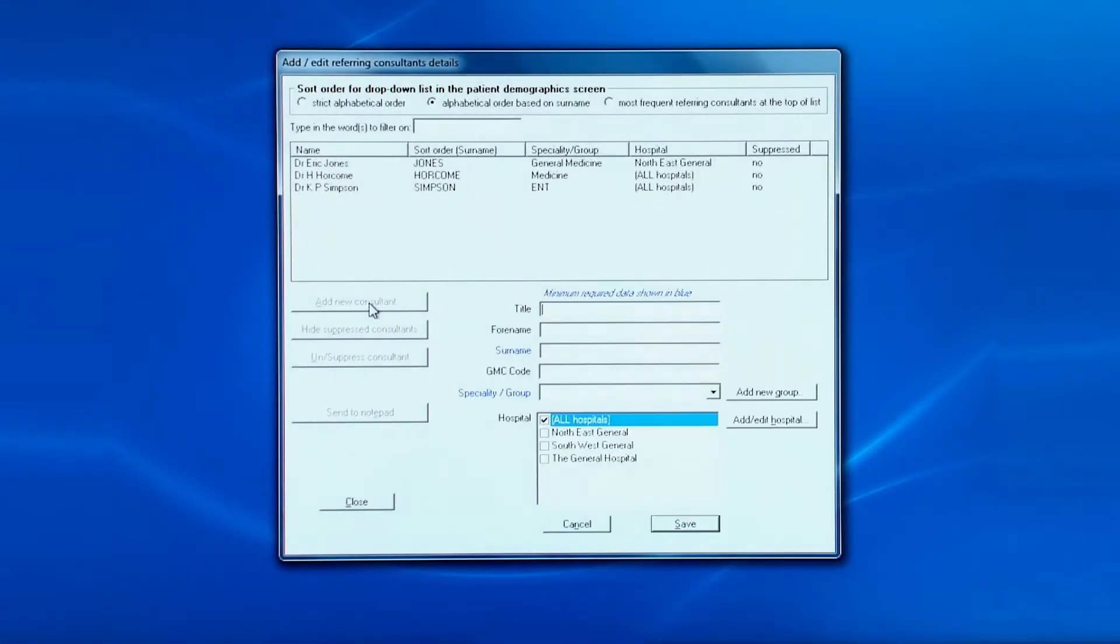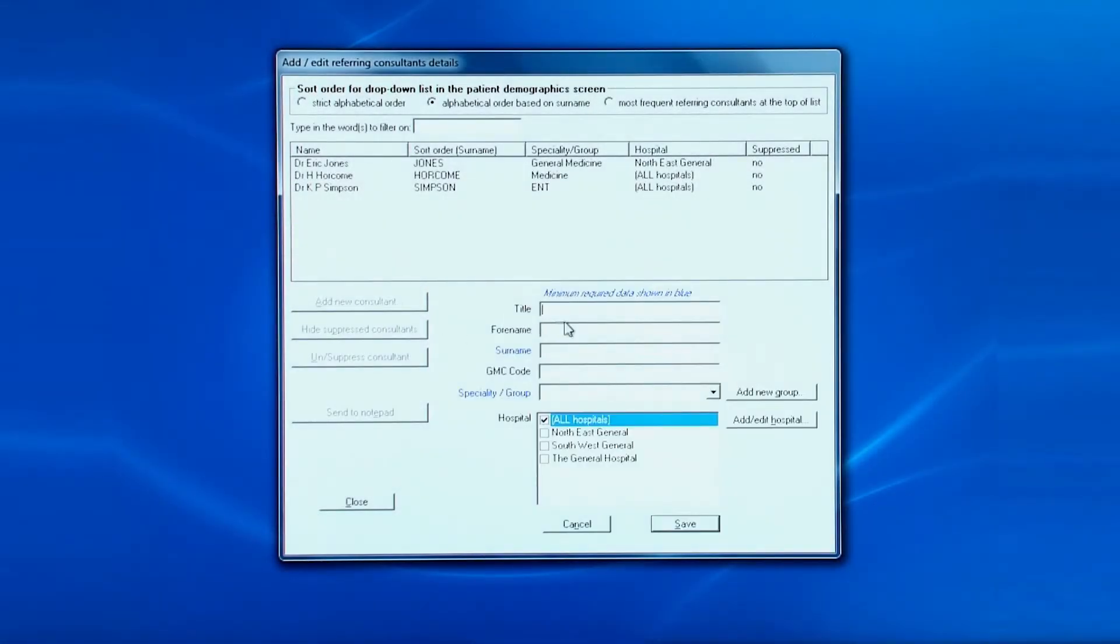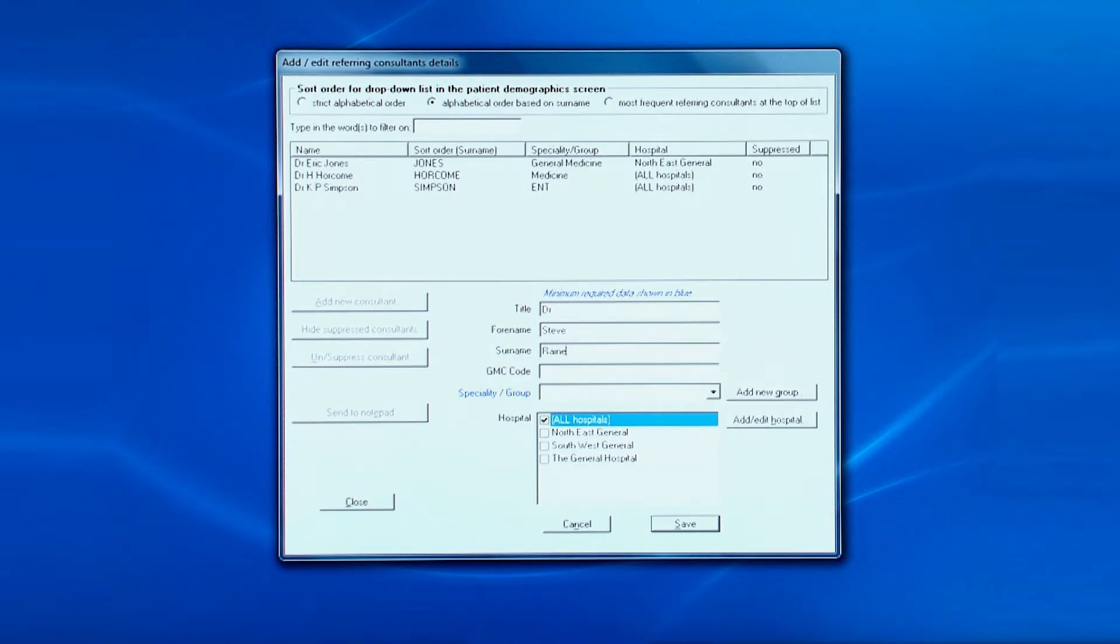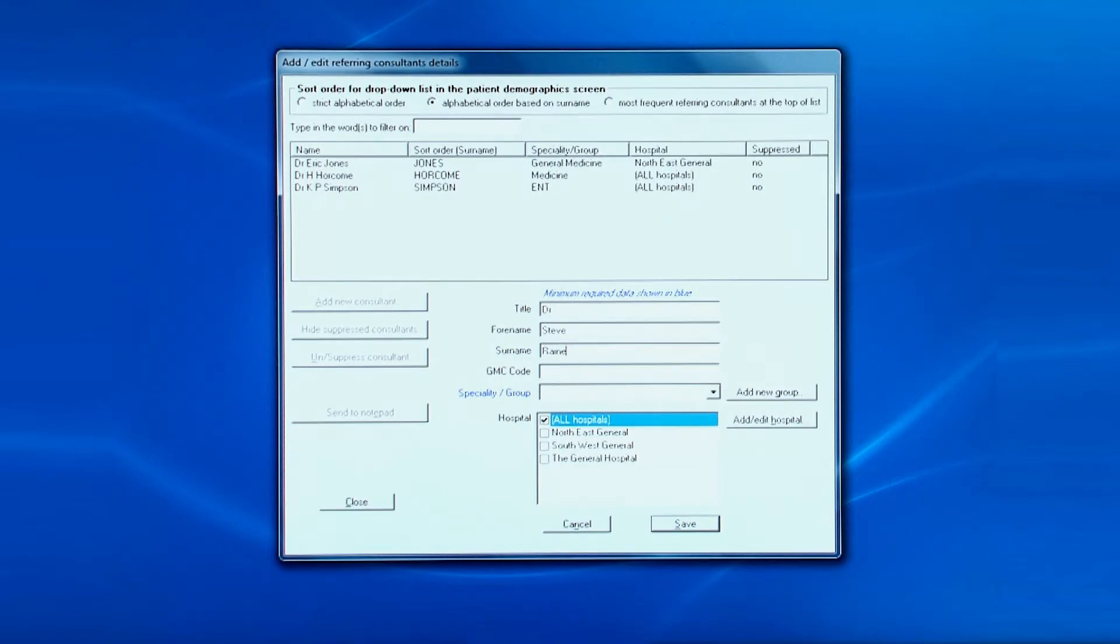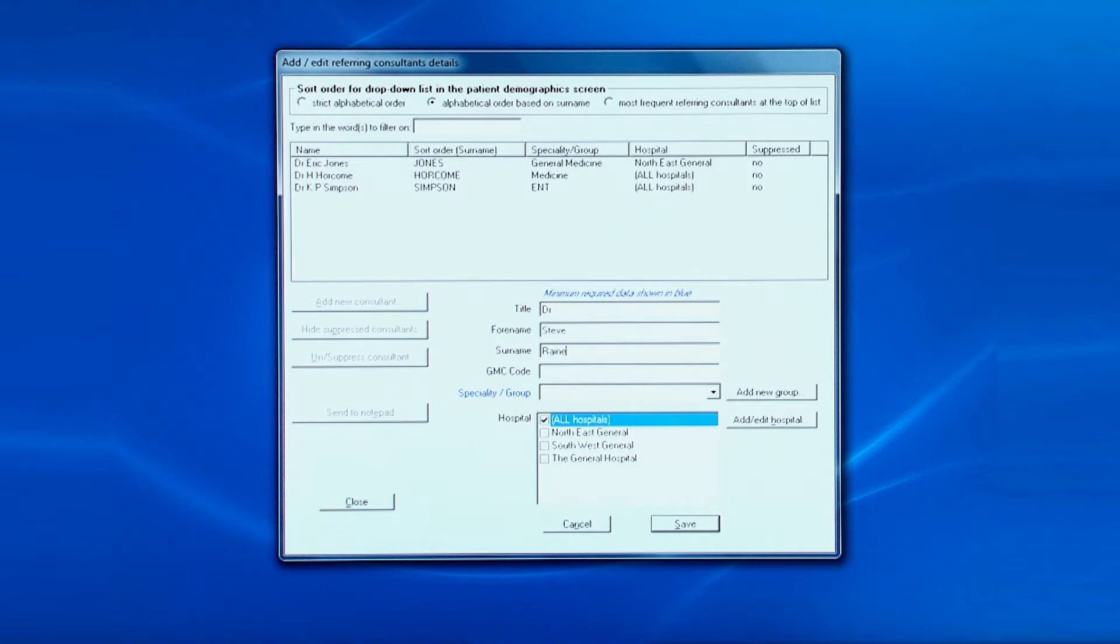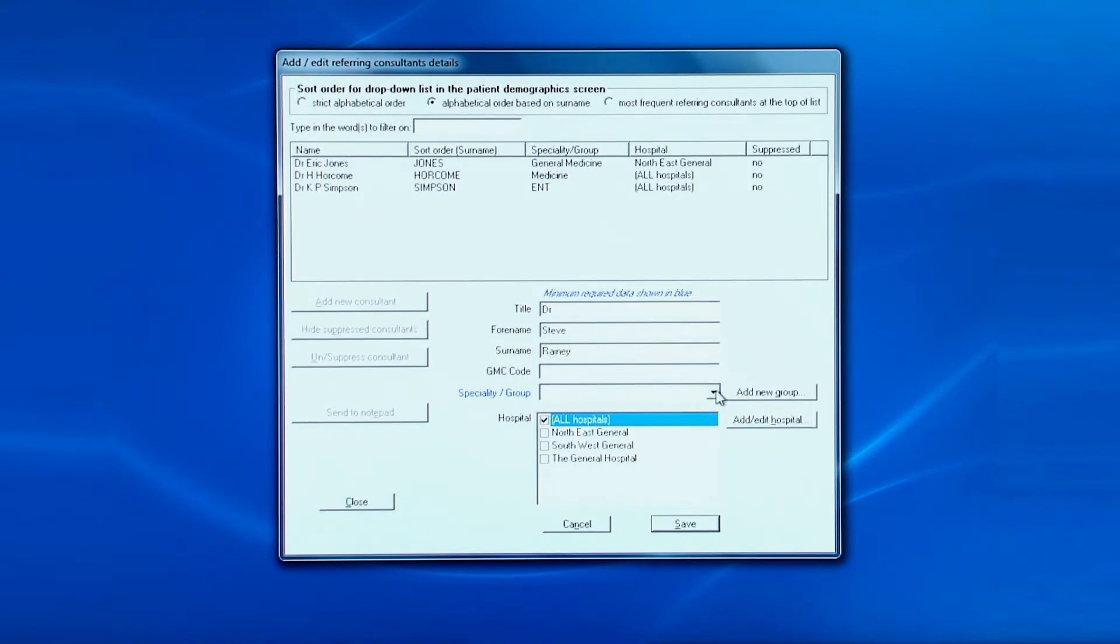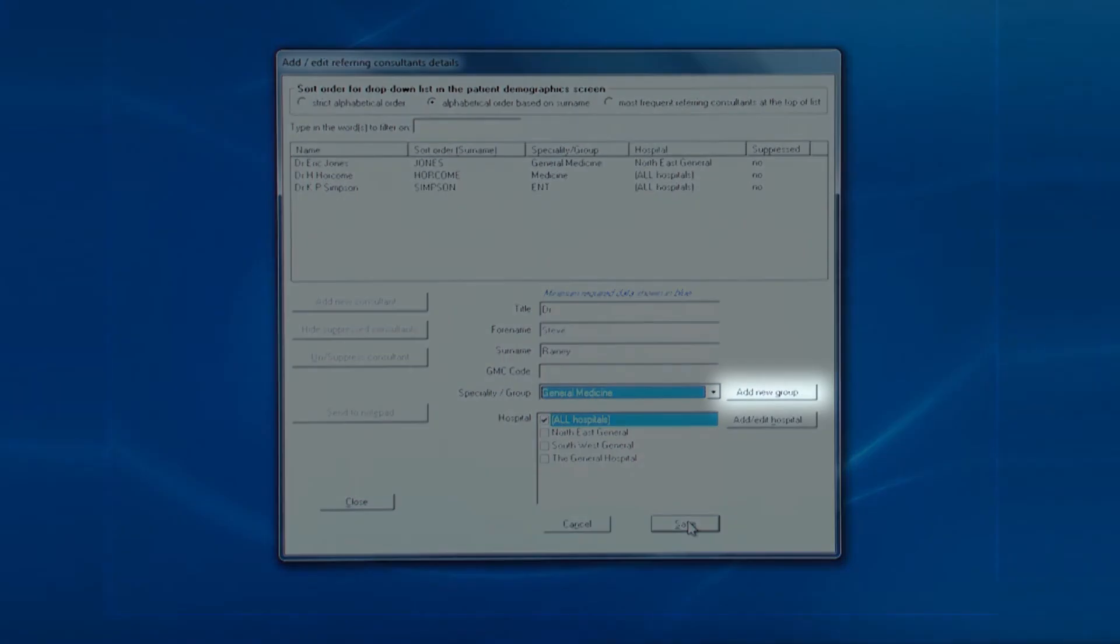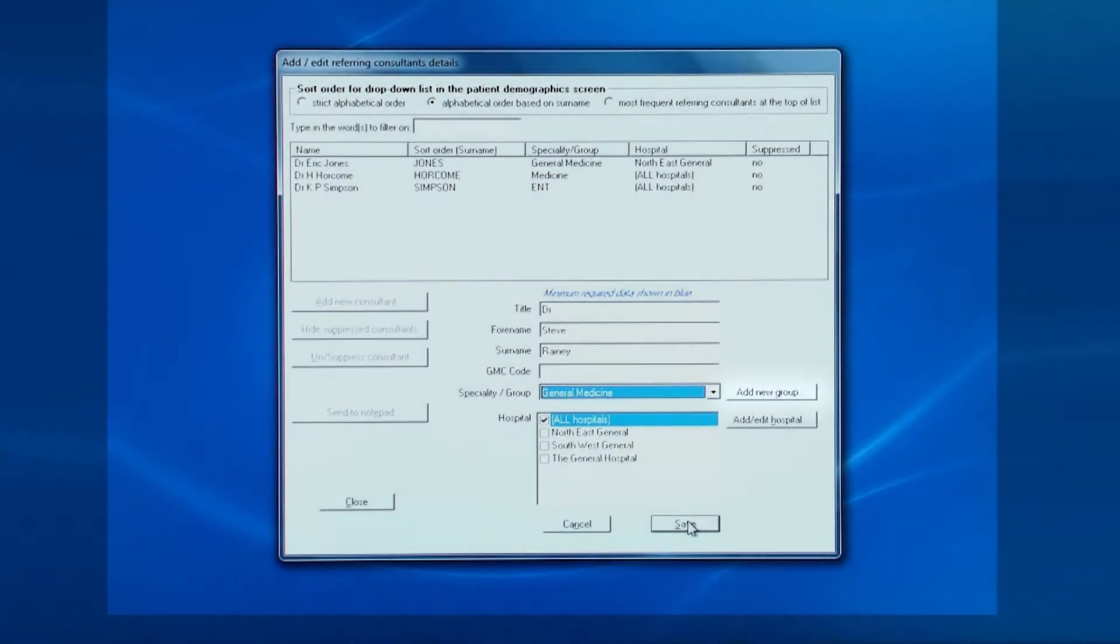You begin by entering their title. Next, their forename. Their surname is in blue as this is an obligatory field. Next, optionally, their GMC number. Then you pick their specialty, and if it's not in the drop-down list, you can add it by clicking this button. Finally, you need to say which hospital they're based at.